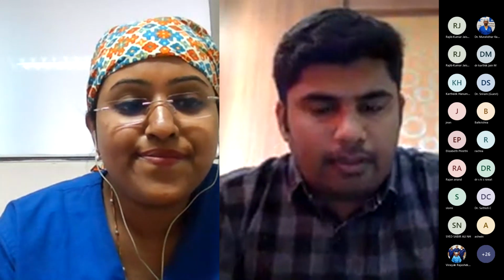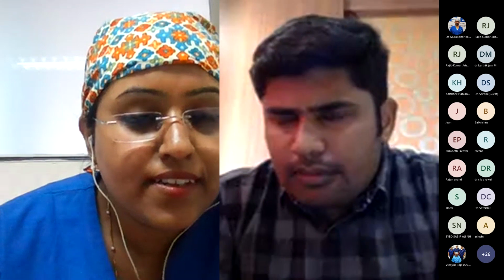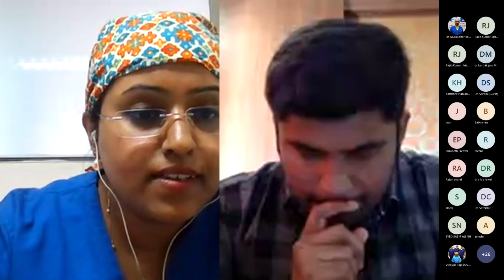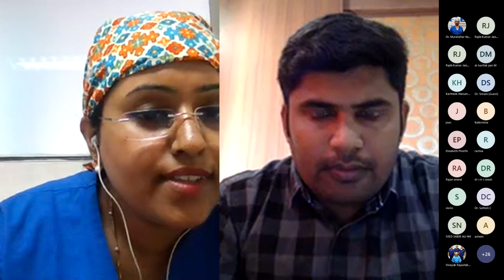Can you hear me? Yes, sir. Regarding the diameter measurements of the aortic root, people measure leading edge to inner edge, and Kirubanand said that it is from leading edge to leading edge. Which is the best one to do? What is the recommendation?